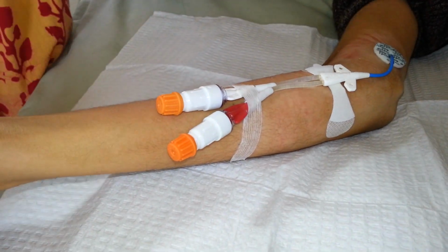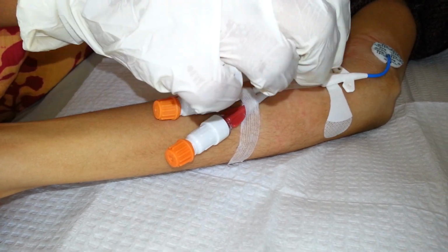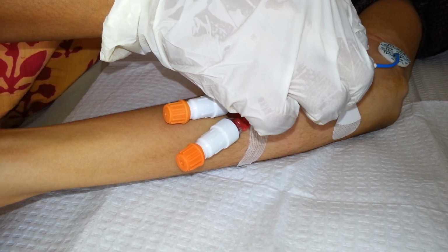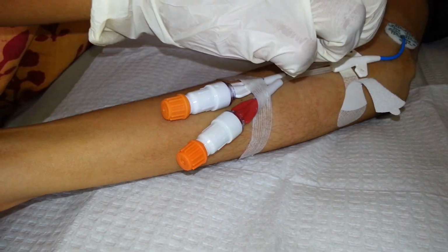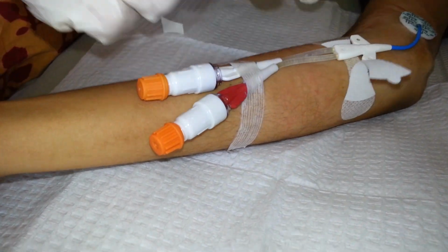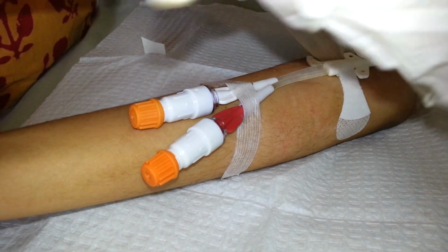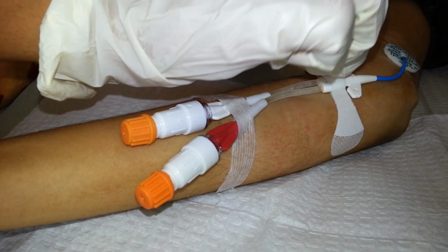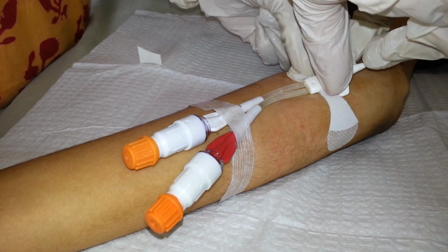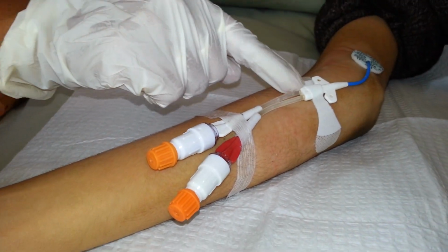Something very important that I want to mention here, as per the recommendations, the hub of the catheter should sit inside the Griplok. But when we used it in that manner, the line migrated out. So we thought of this trick. Instead of putting the hub inside the Griplok, we leave the hub on the top of the Griplok and close it in a way so that it locks the wings of the hub. This secures the catheter extremely well. We have been doing this for 2 years and it works really well for me.